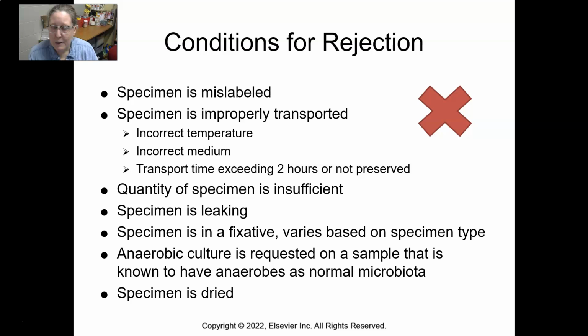There's not enough specimen to do anything with. For some things it doesn't take that much, but there are some tests that require more. One of the issues would be if you were trying to do one of those parasite containers where you scoop in and put stuff in there. If somebody's bringing you baby diapers and it's diarrhea and it's all soaked into the diaper, it can be difficult to get enough specimen.